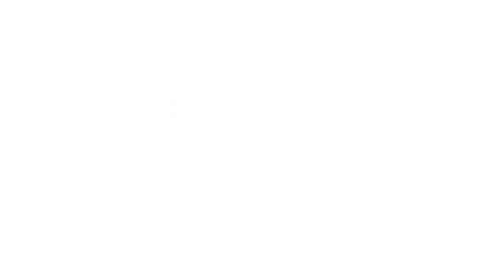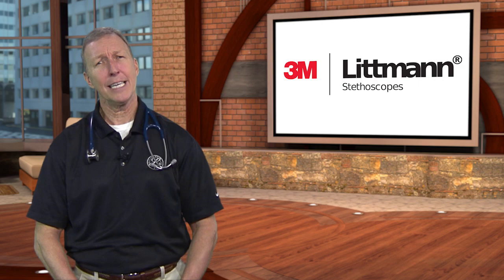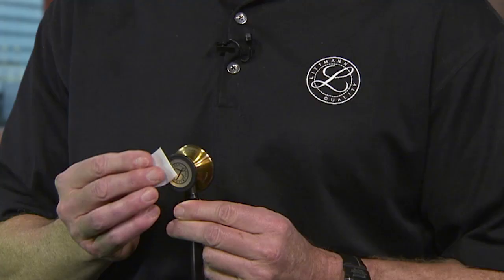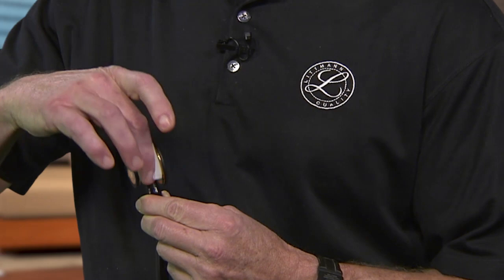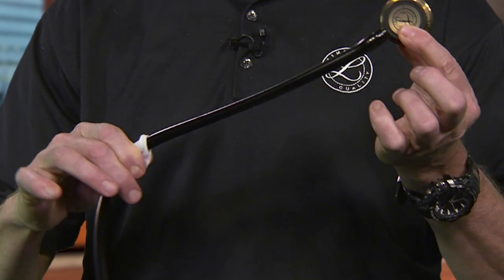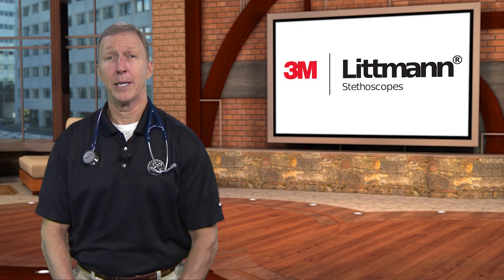Letting your customers know about cleaning their stethoscope will help ensure optimal acoustic performance. Periodic cleaning will help extend the life of the stethoscope and leave it looking shiny and new. To disinfect between exams, a 70 percent isopropyl alcohol solution can be used. For routine cleanings, a cloth with warm, soapy water is recommended. However, do not immerse the stethoscope in any liquid. With varying temperatures that occur globally, it is also recommended to keep the stethoscope away from extreme heat and cold. More detailed information can be found in the owner's manual included in the box.